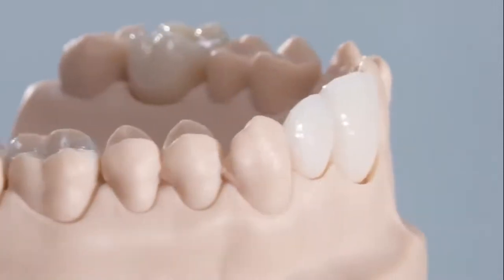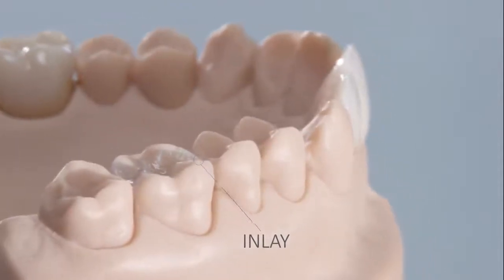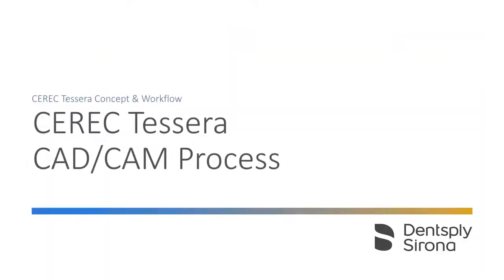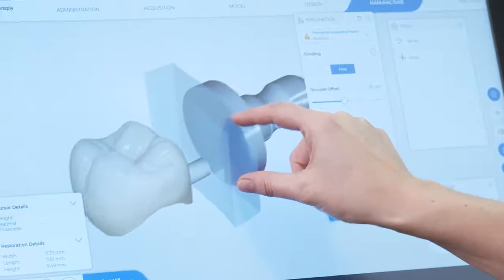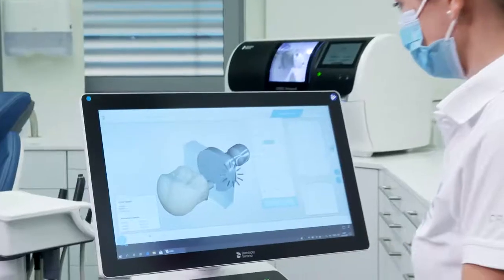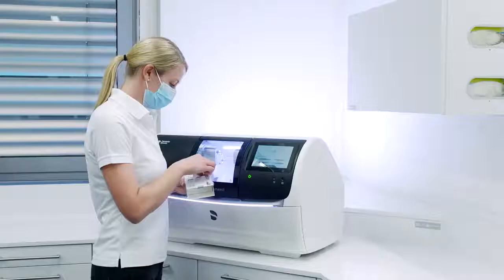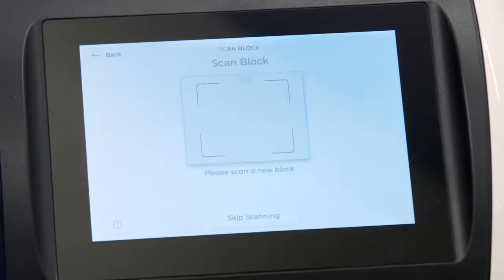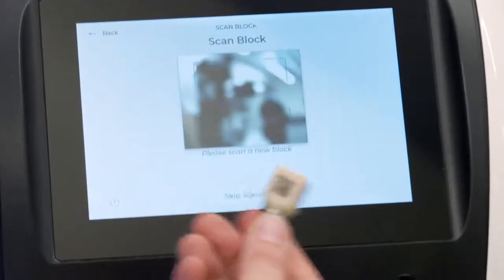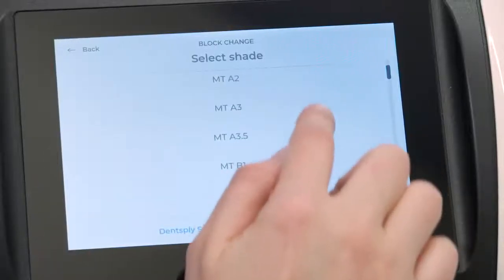In the following, we would like to present the fast, safe workflow with the aim of easy color reproduction for these indications. Cerec Ticera has been validated for use in the Cerec system in combination with Cerec's prime mill or inLab MCXL as a milling and grinding machine, and is particularly suitable for fast and reliable processing. A barcode on the block simplifies the transfer of material properties to the machine.